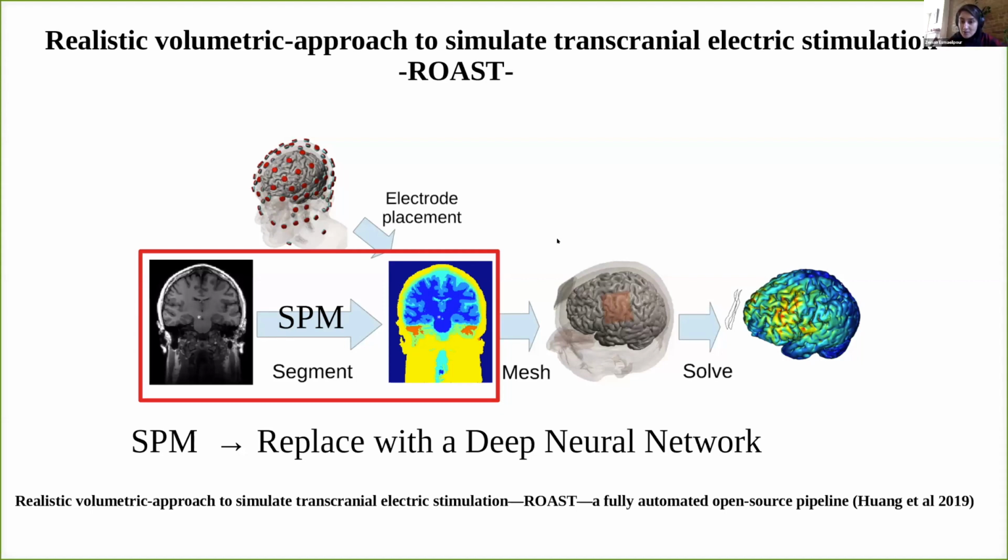Another question: how do you calculate a tissue probability map? The tissue probability map was made with an average of a couple of hundred subjects. This is the same tissue probability map that is currently being used in ROAST. In the ROAST paper there must be a citation. But it's just an average from healthy subjects, around 200 subjects, used to average the specific tissue location for these 6 specific tissues. So in essence, you could make your own tissue probability map for any specific task that you're doing.